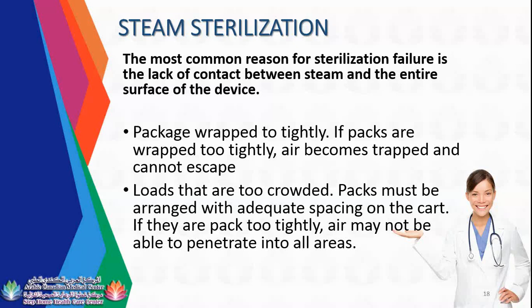Loads that are too crowded: packs must be arranged with adequate spacing on the cart. If you can see here, for every layer of your tray in the autoclave, there should be enough space available. So if you can see every layer, it has space to proceed with the sterilization. If they are packed too tightly, air may not be able to penetrate into all areas.